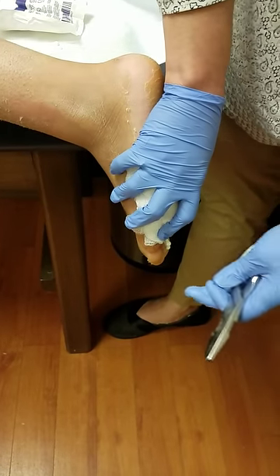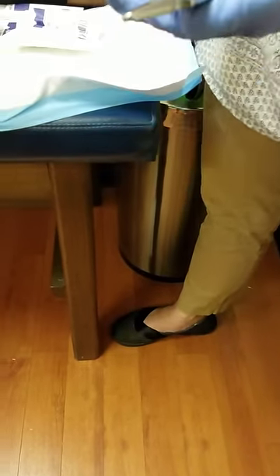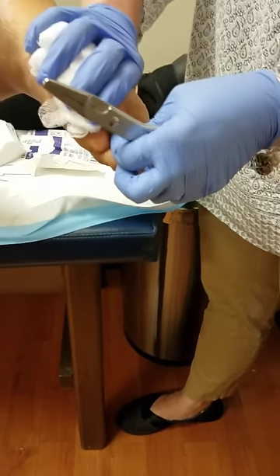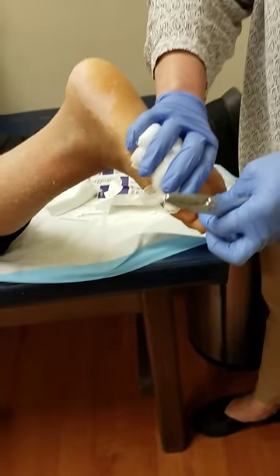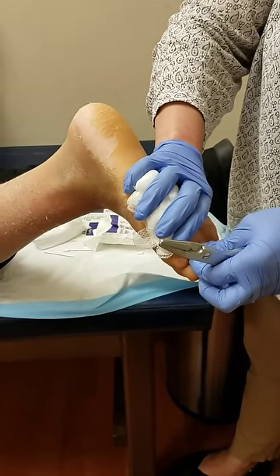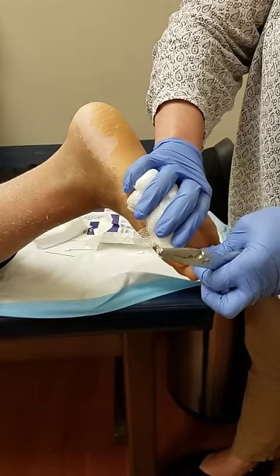Now, with these other ones, bend your knee up for me. There you go. Got two more to go, and that's it, baby. I'm going to take this other cap off, okay? It's like a bruise. It's going to be all right, though.